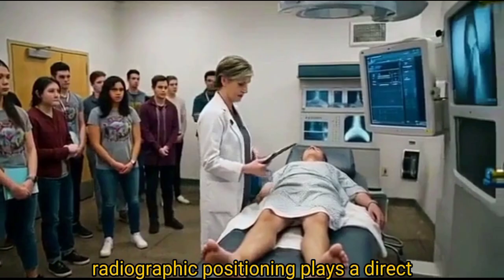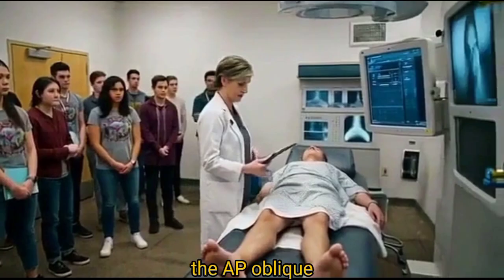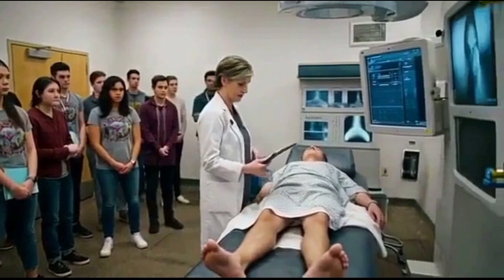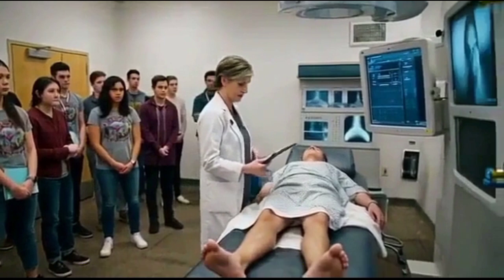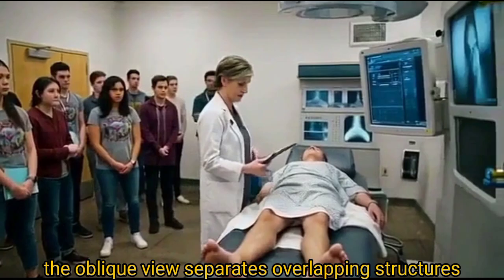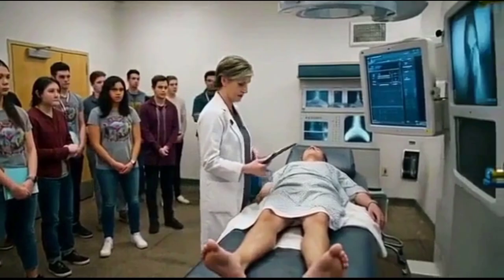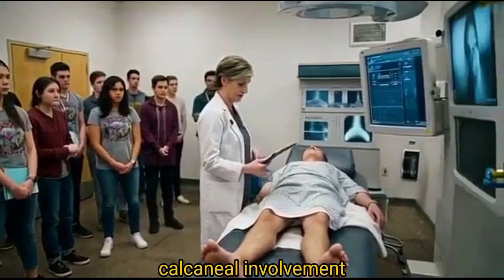Radiographic positioning plays a direct role in whether these findings are visible or missed. The AP, oblique, and lateral projections of the foot must be performed with precision. Each projection serves a distinct diagnostic purpose. The AP view evaluates alignment and overall bone structure. The oblique view separates overlapping structures and improves visualization of subtle cortical changes. The lateral view demonstrates soft tissue swelling, calcaneal involvement, and posterior structural integrity.